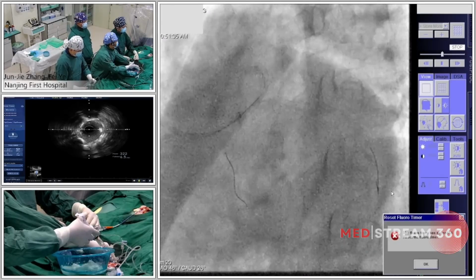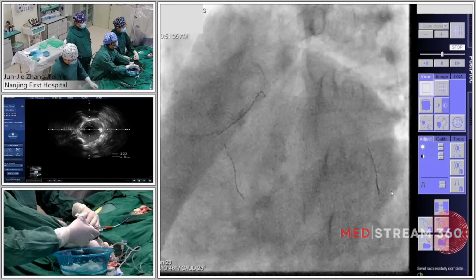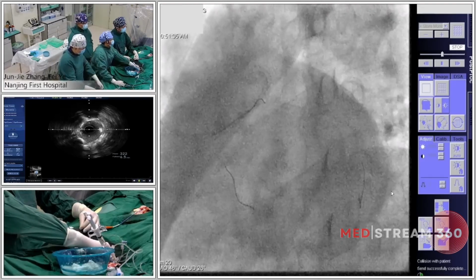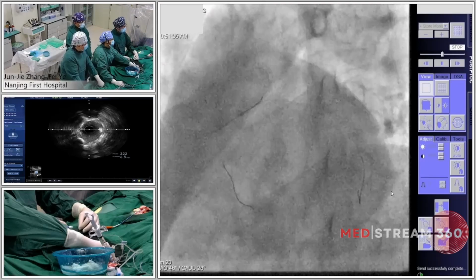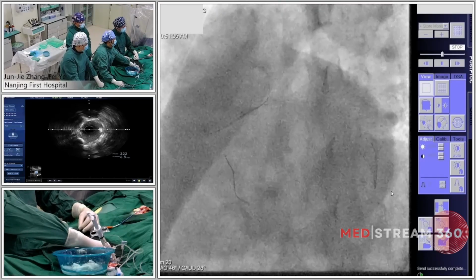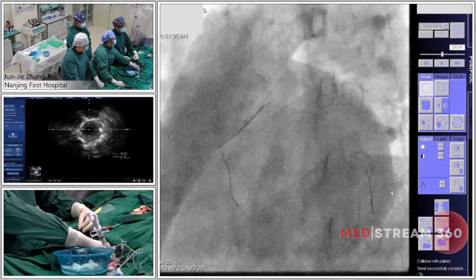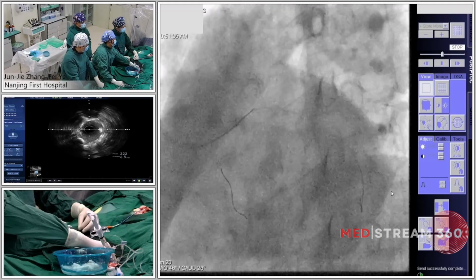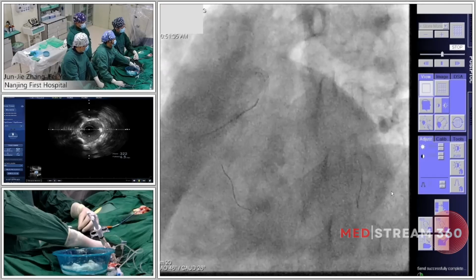Okay. For rewiring, this is the first key point of DK crush. First, we should rewire from the proximal cell, avoiding distal access. Because for a wider-angle bifurcation, if we go from the distal cell, maybe the wire will go beyond, under the stent structure. So that's why we use the first jailed wire as a marker and use the third wire to rewire the circumflex.